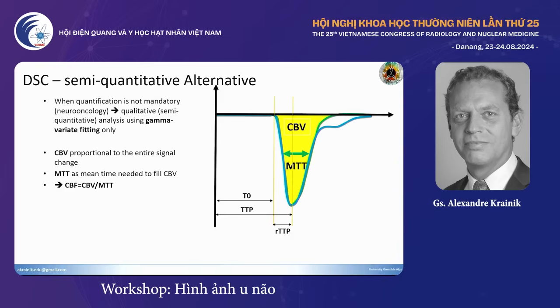I'll give you an explanation. Well, here just to remember that contrary to stroke, for instance, where we really have in mind what are the temporal disorders of the blood in the brain, because it takes too much time to go over the clot and so on, here we are really interested in the density of brain vessels in the parenchyma, because it's an indicator, a biomarker of malignancy, or it can be an indicator of malignancy.